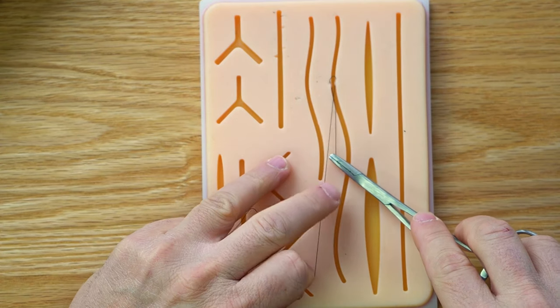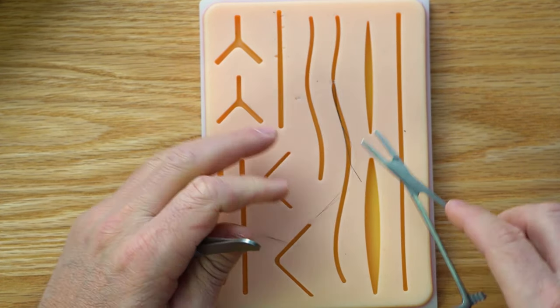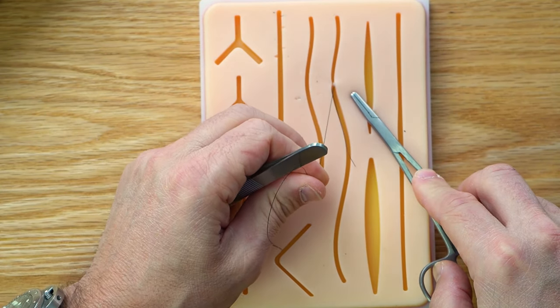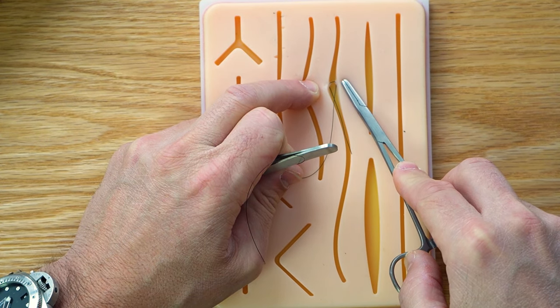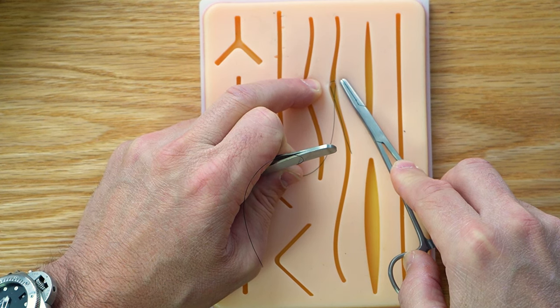What I do is pull these two together and see how that skin comes together. Now, this is not going to come together the same because it's rubber and not real skin, but that's a pretty good spot. If I open that up, I can see that they're pretty much the same depth, and if this was the dermis, it would be pretty good.